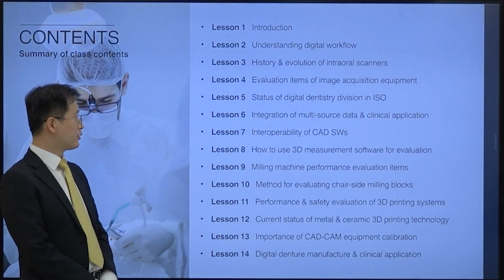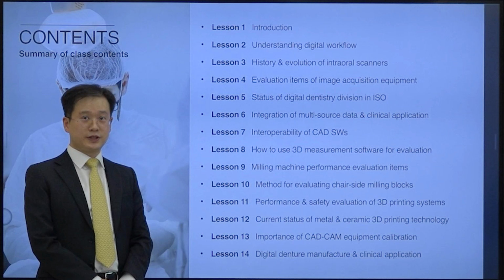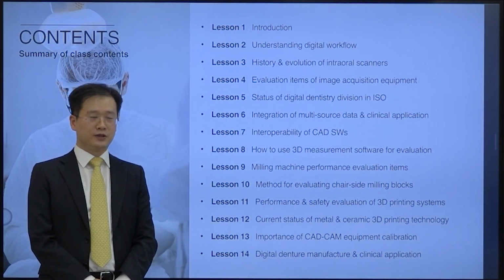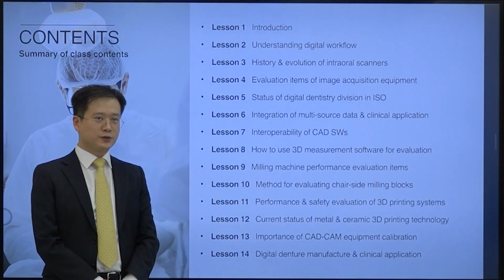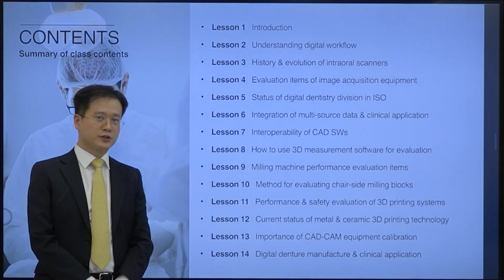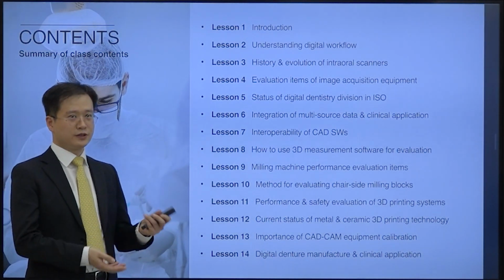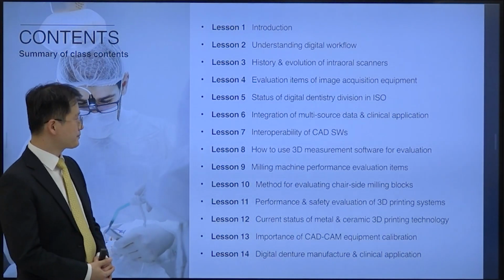Lesson 7 will be interoperability of CAD softwares. There are many dental CAD softwares, but after we save the project data on one CAD software, we cannot load it on another software. The ISO specialists are working on interoperability, and after those standards are finished, we can freely operate those project data on various dental CAD softwares.